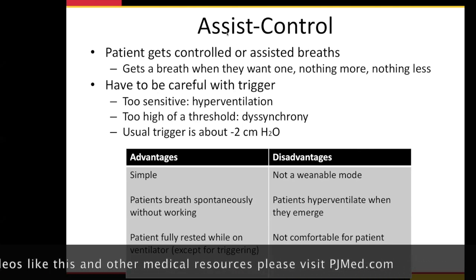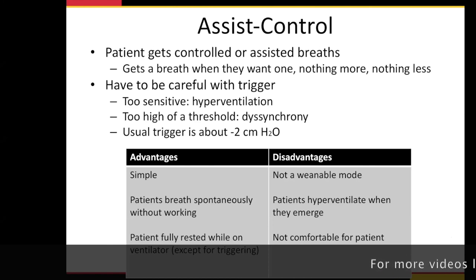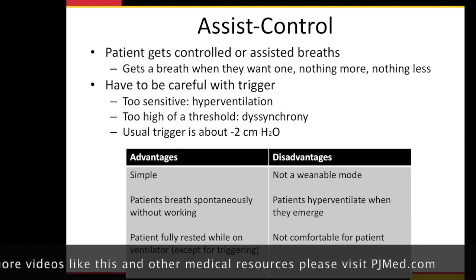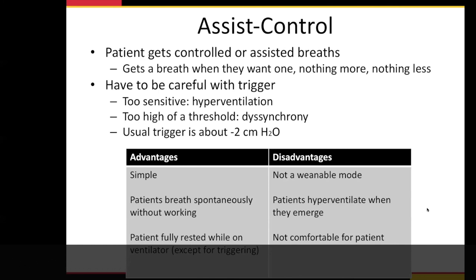Where it's confusing is you see this word assist here. That's really not how this is used. You can allow the patient to breathe, and I'll show you a picture in just a second that explains this. But in the old days, we used to call this mode continuous mechanical ventilation, okay? Simple, the patient is fully rested. Most of these patients are gonna be on heavy duty sedation, maybe paralyzed. If you're proning a patient, this is a mode oftentimes we'll use.